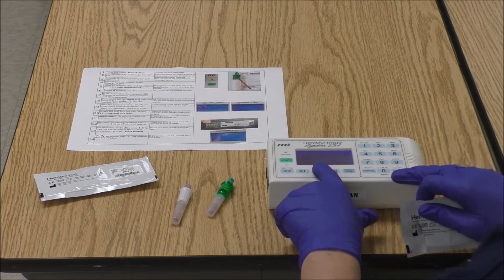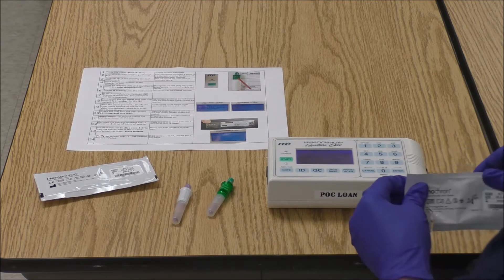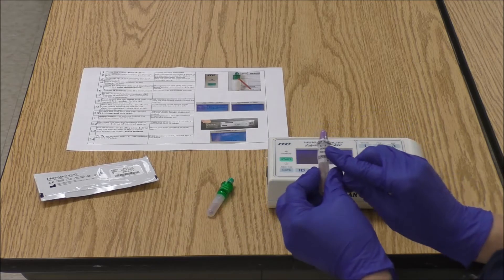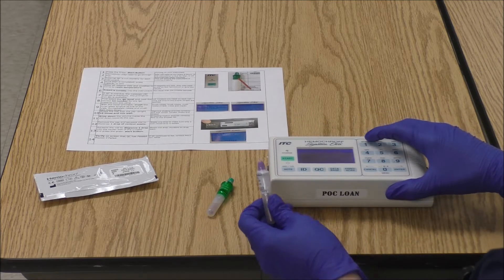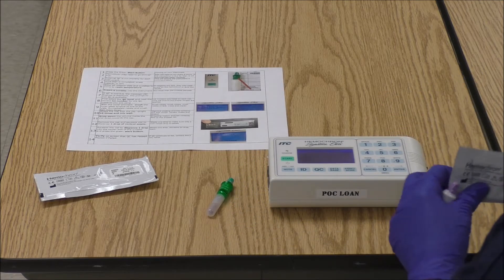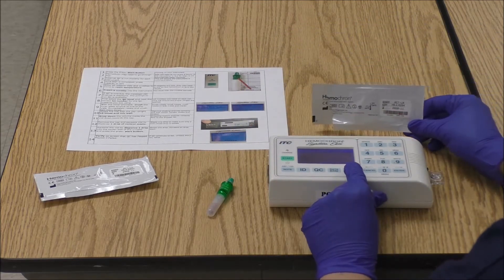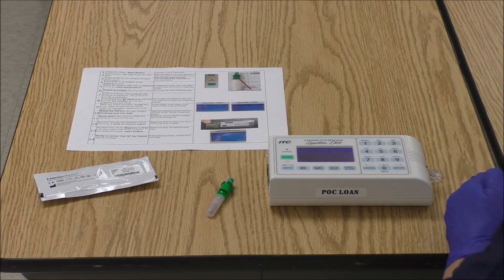We want to run QC, so press the QC button. Now we're going to select what level of QC we want to run. Let's run the normal level — I will press 1 for normal. Then I'm being asked to scan the cuvette lot, so I'm going to hit the print scan button and scan the cuvette lot number that was on the wrapper that was on the cuvette.